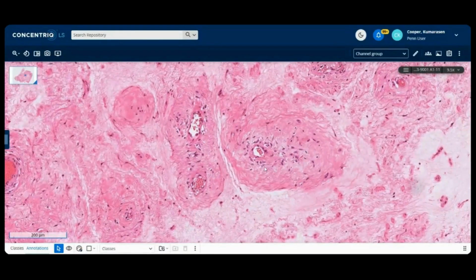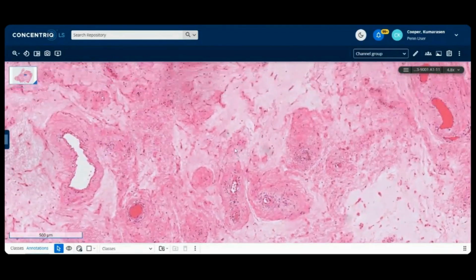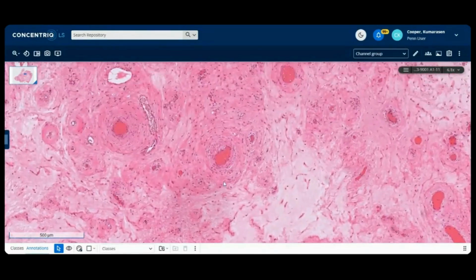What else? Desmin. So myofibroblastoma, the way I think about that, is much more uniform rather than these varying sizes of vessels; the cells are spindled, ovoid, much more uniform. Desmin and CD34 positive. And RB1, of course, is lost. So that's another useful clue in that regard. Cellular angiofibroma, also CD34 positive, RB1 loss as well, but no desmin to my knowledge. So you have to play around with these markers, keep them in your mind when you approach these tumors. No two tumors look alike, and you generally have to use the markers to good effect.